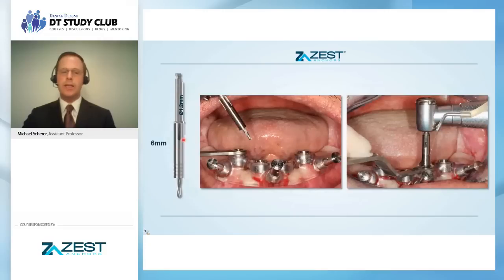And what we're doing is relying upon the drill stop to provide trajectory control for our implant. So you see here, this is our implant drill, the 1.2 millimeter pilot drill. And what we're doing is relying upon the width of this drill stop to control whether it tilts one way or the other. And then you say to me, but doc, what's controlling the most important thing, which is the stop? How do I know if I'm going to stop before a nerve?